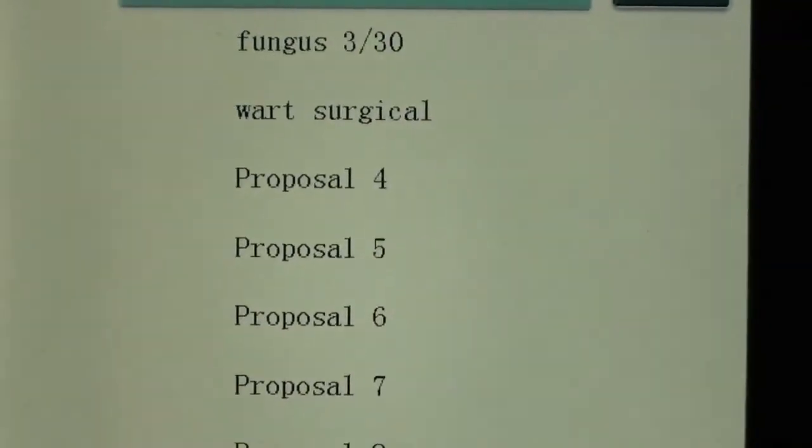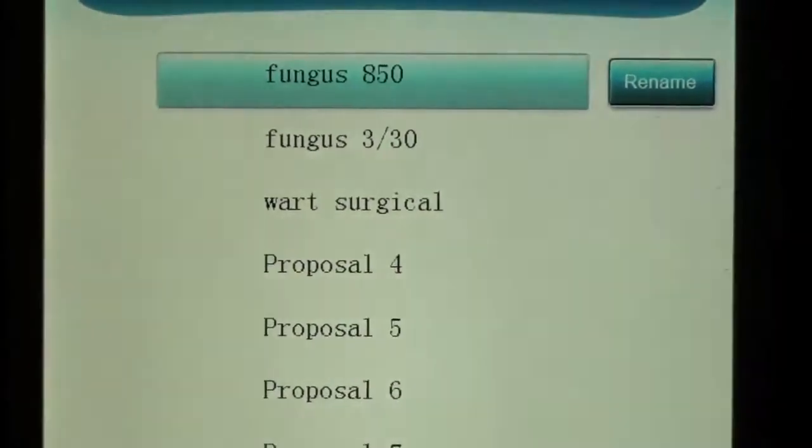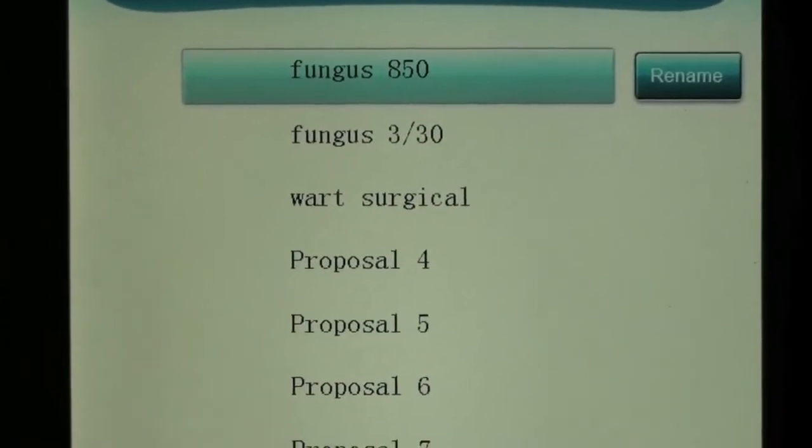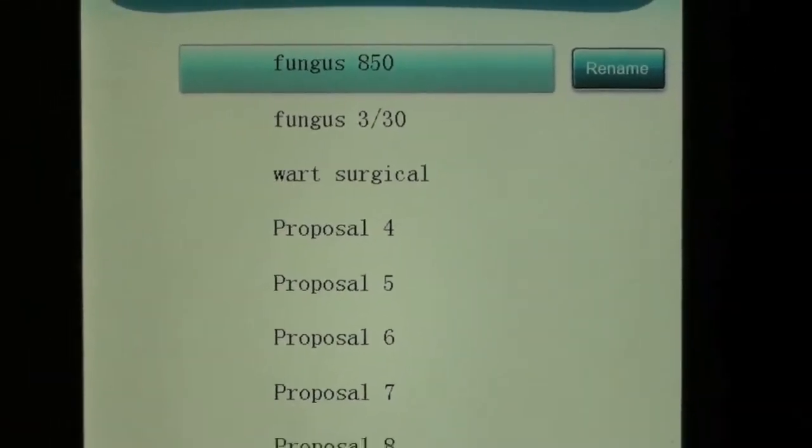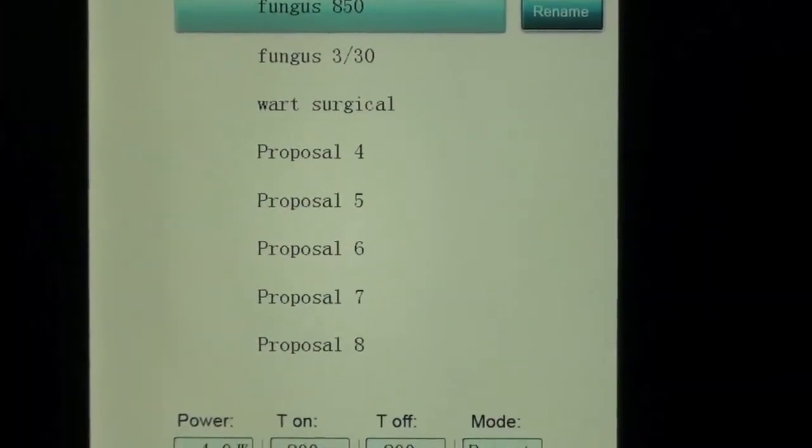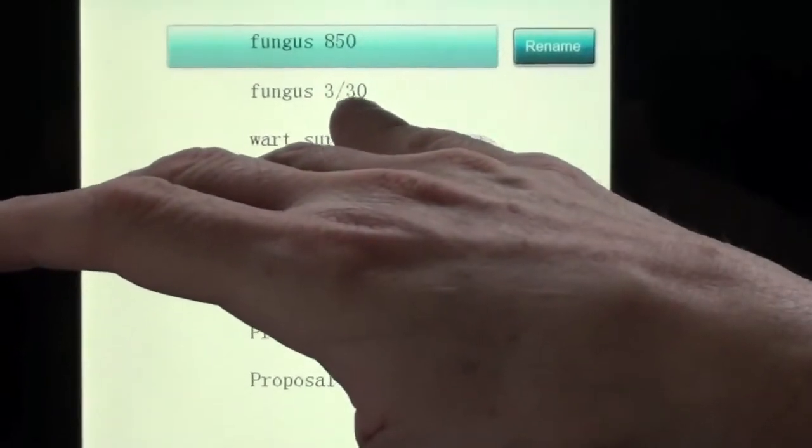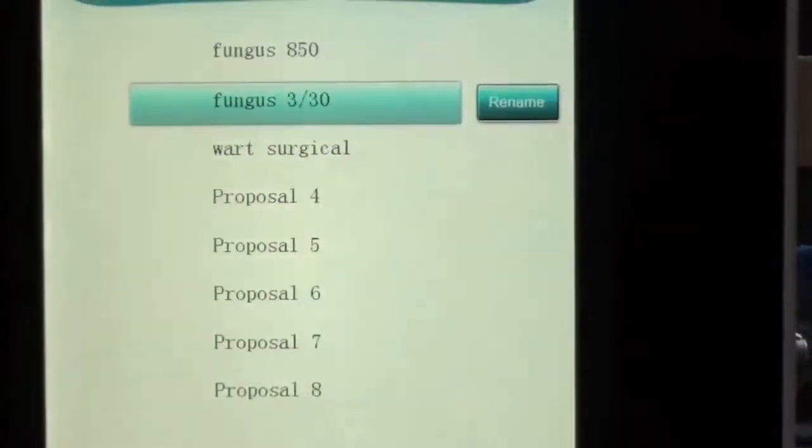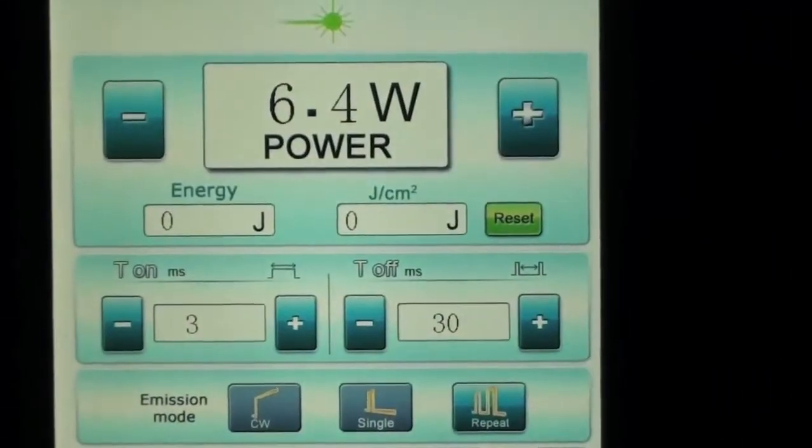We have a couple of proposals. We've got an 850. We've got a three and thirty, three millimeter. Excuse me, a three, it could be also a two millimeter or a 400 micron which is a two millimeter and a 600 micron which is a three millimeter. That's three, three milliseconds on and 30 milliseconds off.